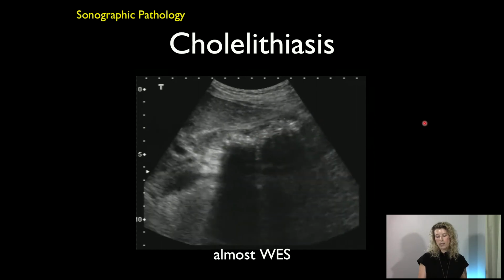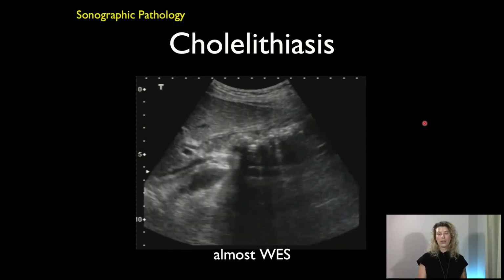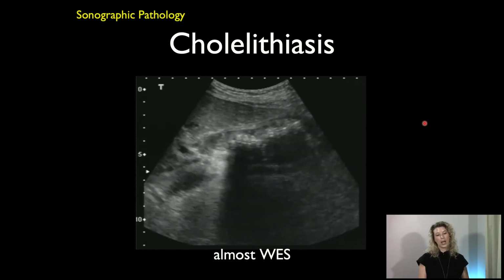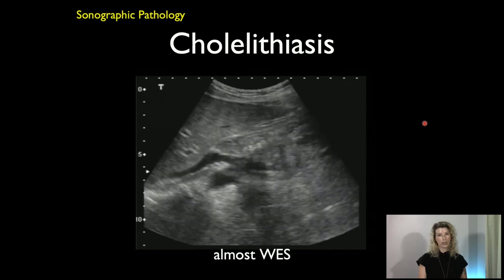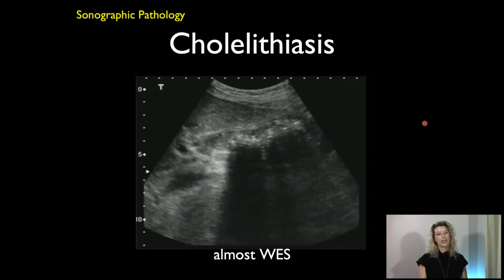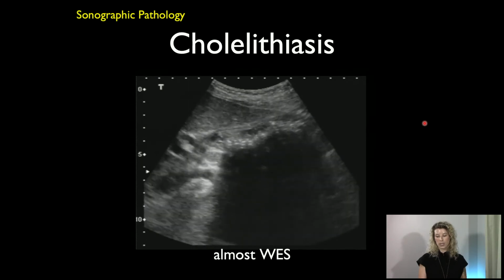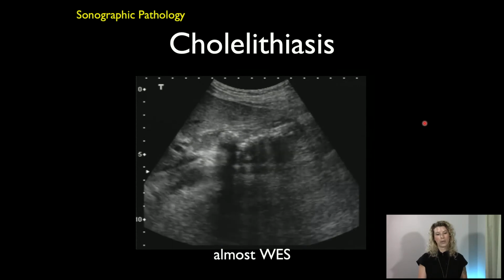This is something that if you encounter and you're pretty sure it's in the gallbladder, I very much recommend you getting more definitive imaging because you don't want to miss something like abscess of the gallbladder, which can look very similar to this and is a very serious diagnosis that you do not want to miss. So this is a really advanced diagnosis, and even myself, I would get more definitive imaging for this.